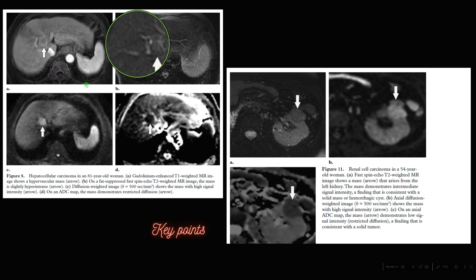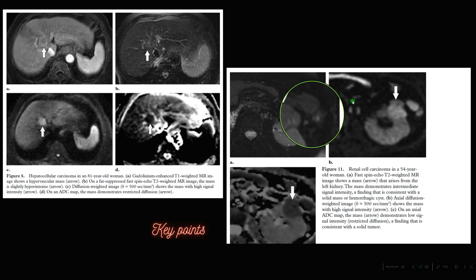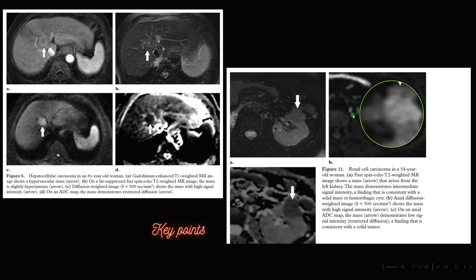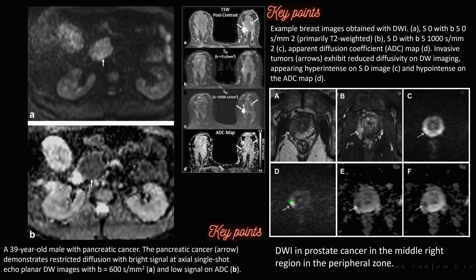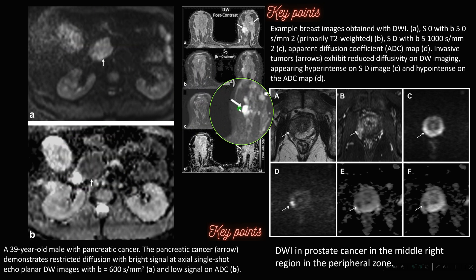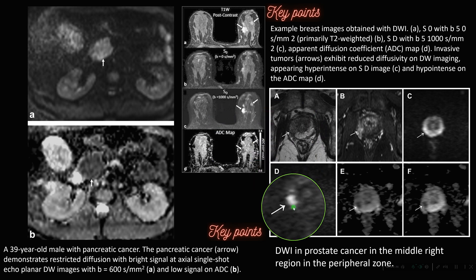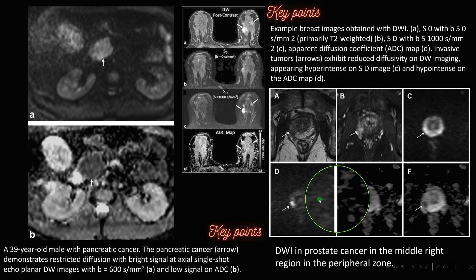DWI also helps in identifying hepatocellular carcinoma — this was a case of HCC showing restricted diffusion on DWI with low ADC values. DWI helps in identifying RCC as well, showing restricted diffusion with low ADC values. DWI helps in identifying pancreatic carcinoma showing restricted diffusion with low ADC values. In the breast, restricted diffusion with low ADC values was seen in a case of breast carcinoma. This was a case of prostatic carcinoma showing restricted diffusion in the peripheral zone with low ADC values.